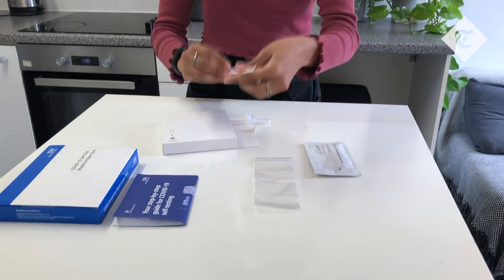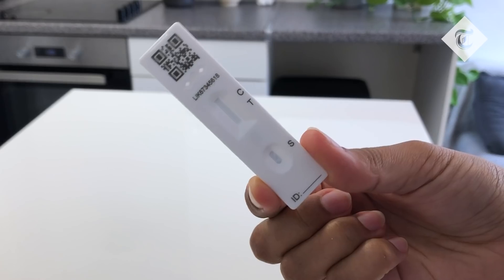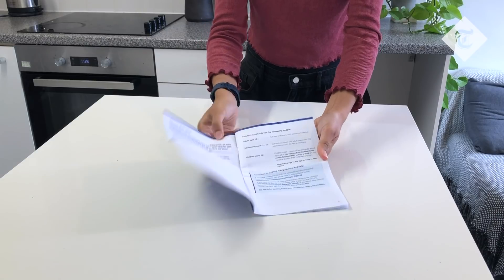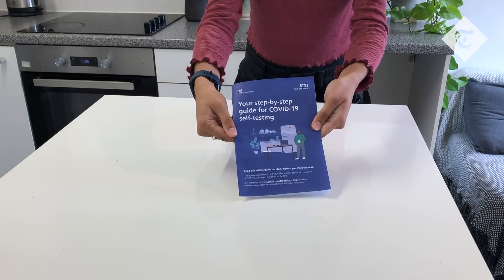Next, check your test kit. Make sure none of the contents have been damaged. You should have a sealed swab, a tube with a dropper, some extraction fluid, a test cartridge, and a waste bag. Double check the instructions in your packet as they may vary from model to model. Some kits for example just require a sample from your nose, but this one requires a sample from your throat and nose.